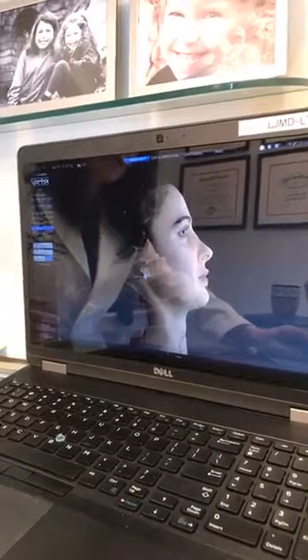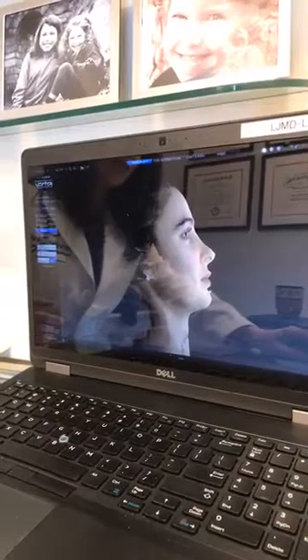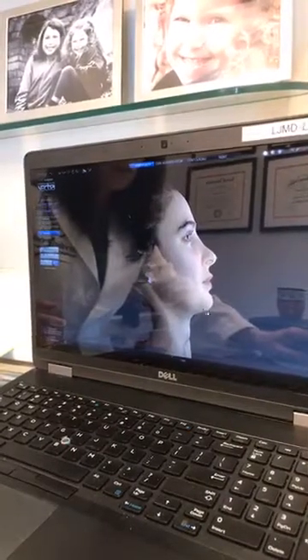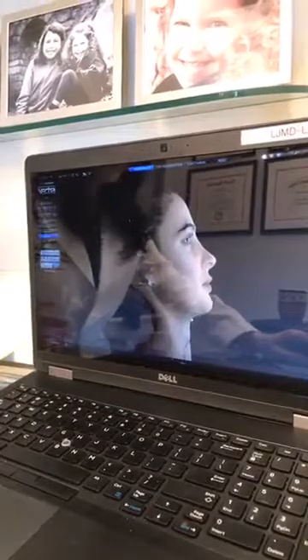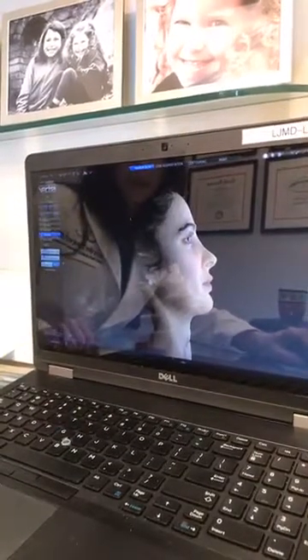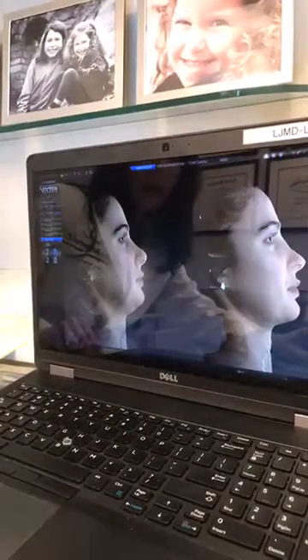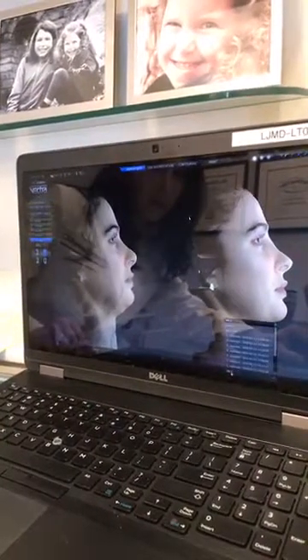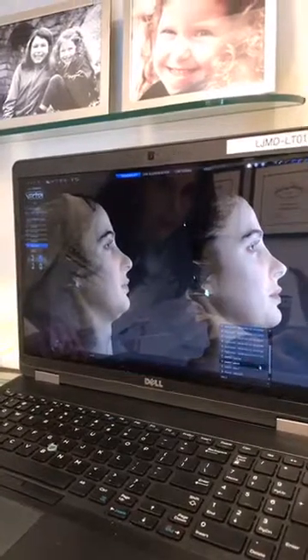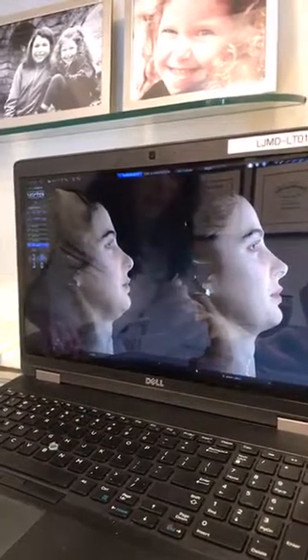So Kristen doesn't have this problem because her chin is actually in great position, but often people might benefit from a chin implant or a submental liposuction, so we always want to assess those areas while we're doing a rhinoplasty. And then, if we want to see what our results look like, then you can see something like this.